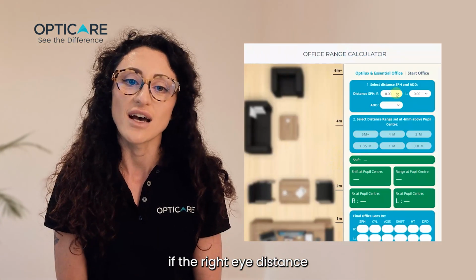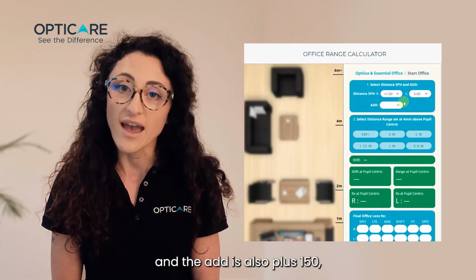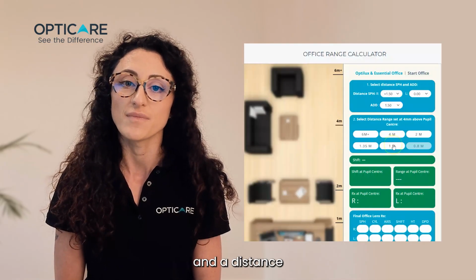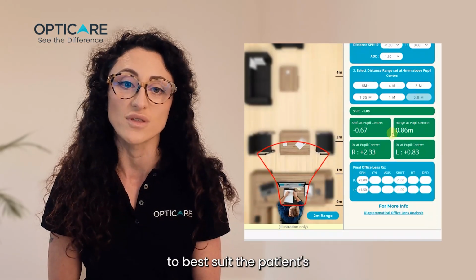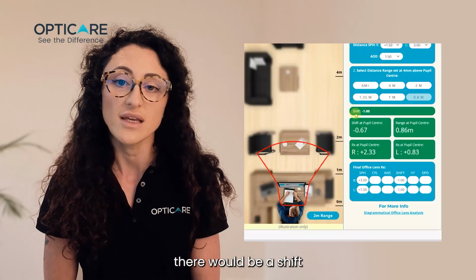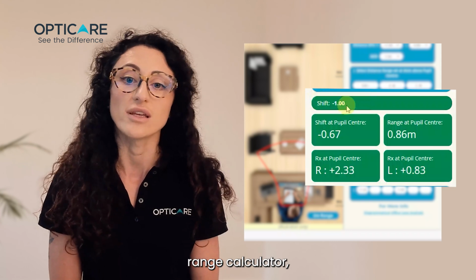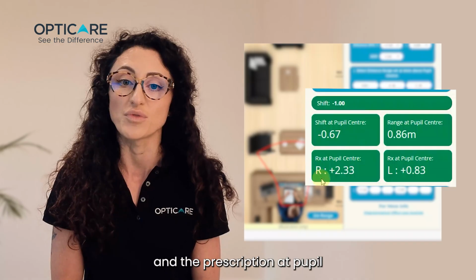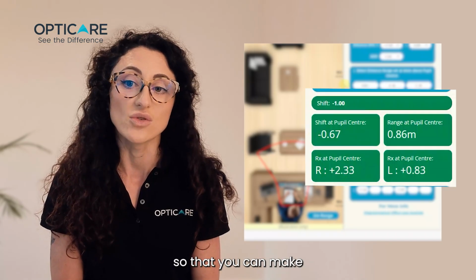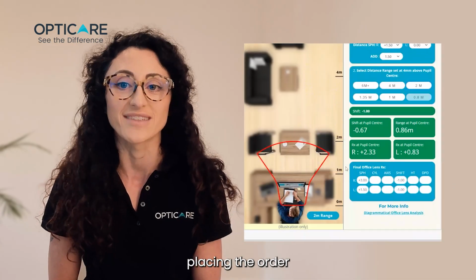For example, if the right eye distance prescription is plus 1.50 and the add is also plus 1.50, and a distance range of 2 meters is selected to best suit the patient's office environment, there would be a shift of -1. As seen on the Office Range Calculator, both the shift at pupil center and the prescription at pupil center are displayed so that you can make the most informed decision for your patient before placing the order.